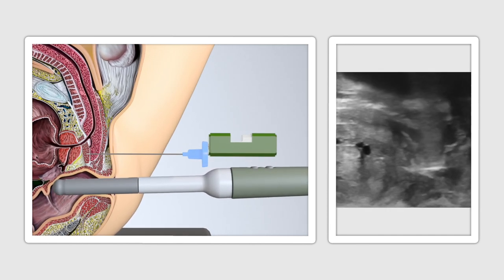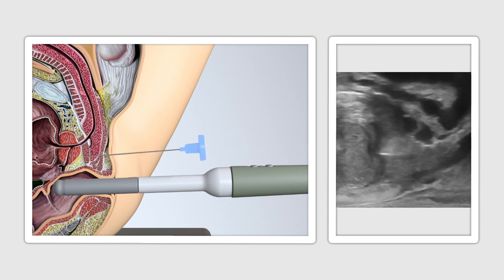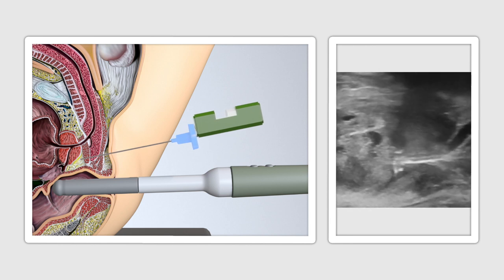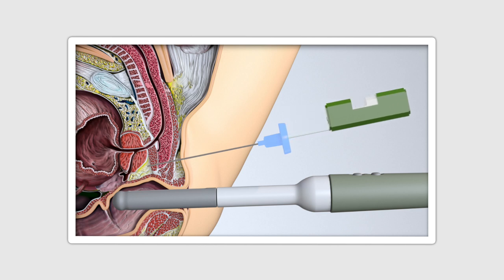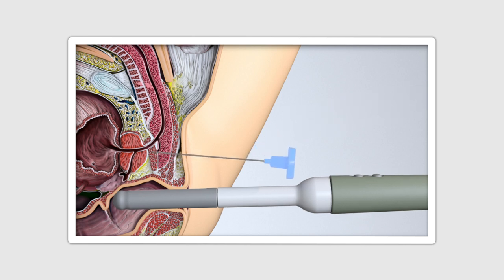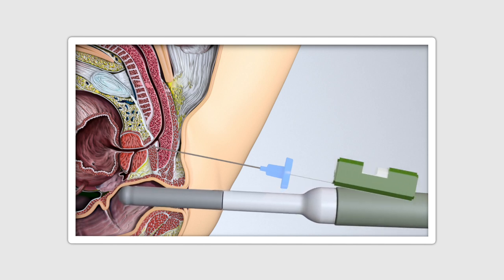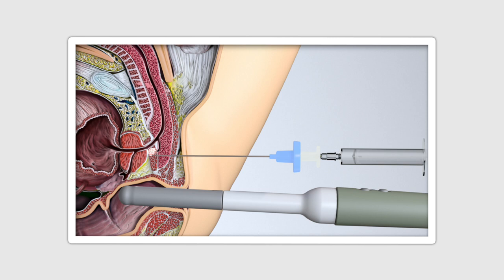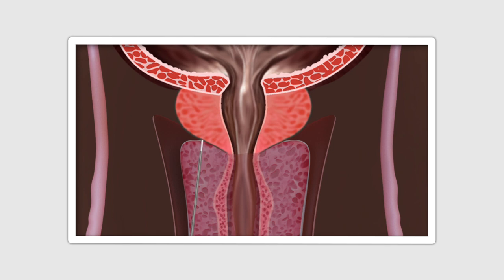Under ultrasound guidance, the cannula is directed to different areas of the prostate for samples to be taken. At all times, the end of the needle and the direction of travel are visualised through manipulation of both the linear ultrasound probe and the biopsy cannula. The free-hand movement that the CAMPRO probe affords means that apical, basal, and lateral areas are easily accessible. If the positioning of the cannula needs to be altered, this can be easily achieved by reinserting the local anaesthetic needle, reinserting the cannula, and if necessary deploying a little more local anaesthesia. In pilot trials, separate skin punctures are almost never required because of the malleability of the perineal skin and subcutaneous tissues.